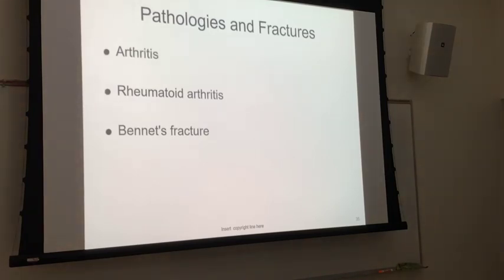Have you ever seen somebody whose fingers just look kind of deformed? Usually older patients, with their fingers going in different directions. That's usually because of rheumatoid arthritis. Whenever you take an x-ray of a patient with rheumatoid arthritis, the bone looks a lot like a patient who has osteoporosis. The bone is just degenerating, especially at the articular ends. The bones are basically dissolving.